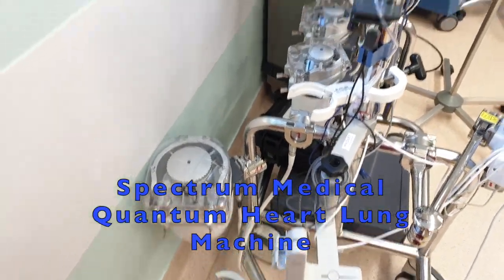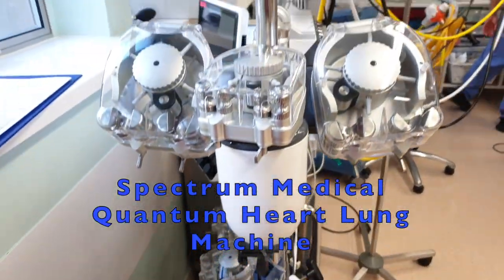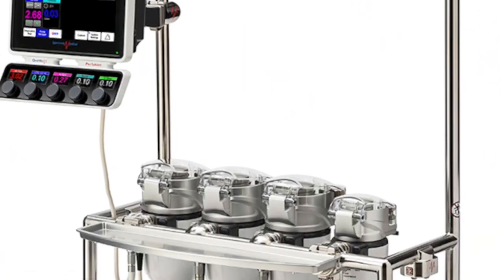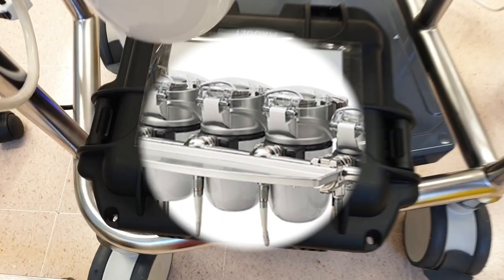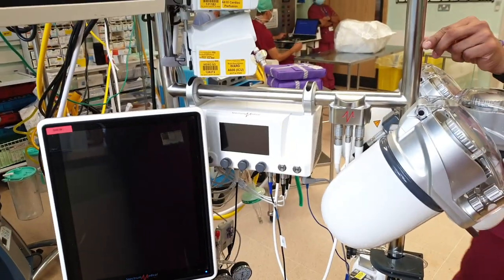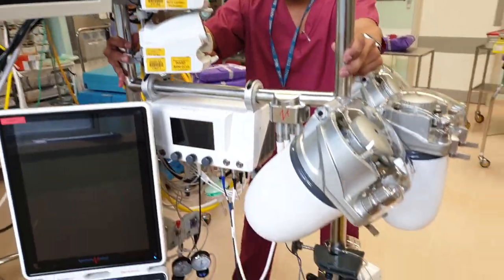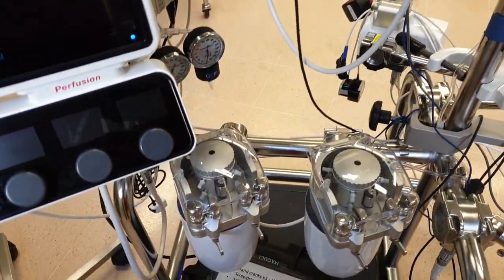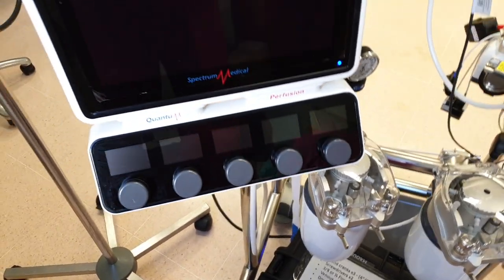They have two configurations. One is Cheltenham frame. What you see is the Cheltenham frame. And this is the New York frame. In this video, we are going to see the functioning and the use of quantum heart-lung machine in real cardiac theater.